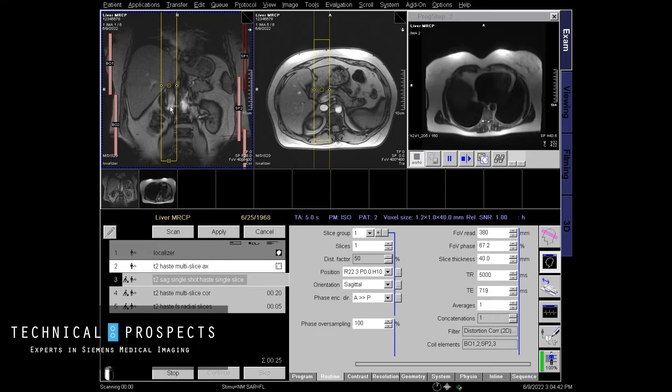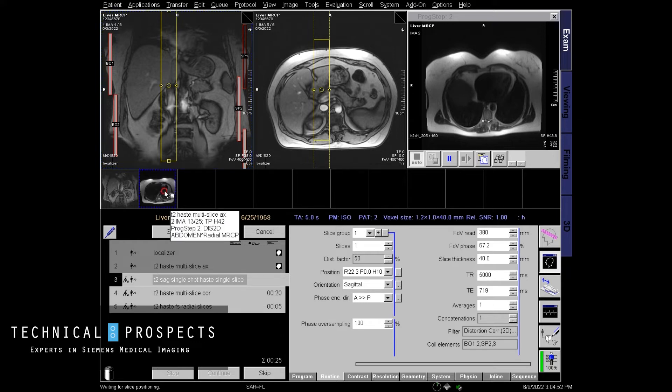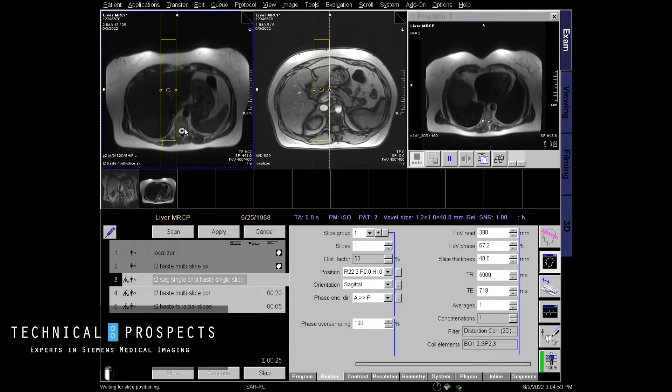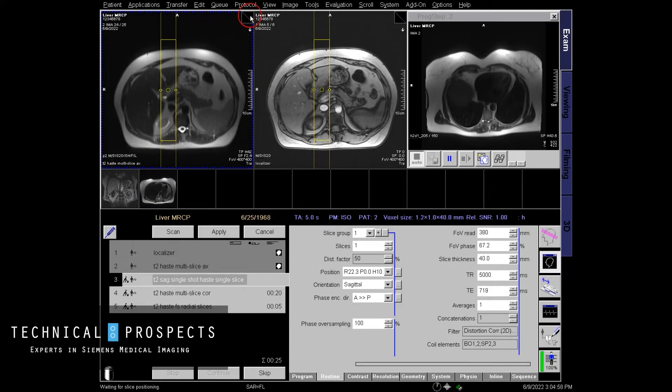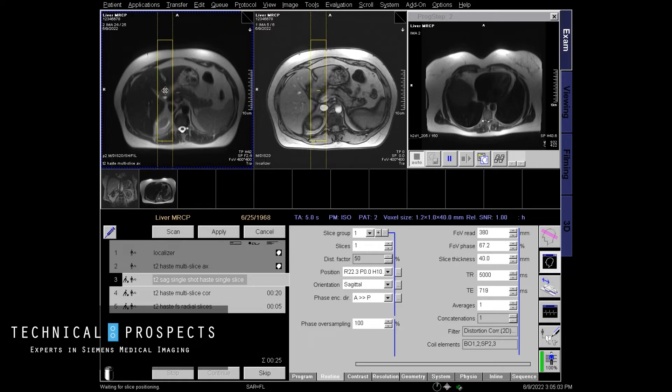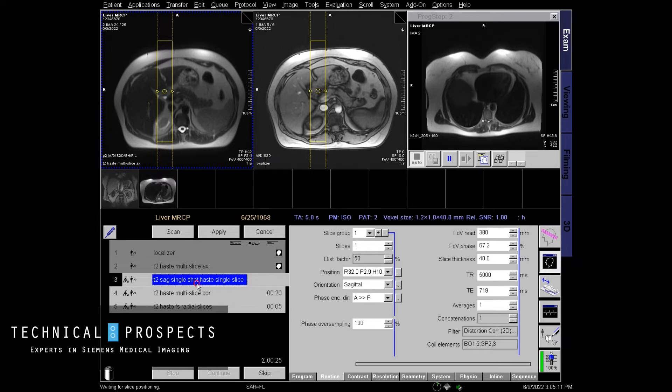And if you run a straight coronal through that sagittal, the coronal is not going to get the biliary tree all looking nice like a normal tree would look like. A lot of people don't run this particular sagittal. I like to run it. So this little dot right here is what I'm shooting for. That's probably the entrance of the biliary tree where the gallbladder exits into the biliary tree.